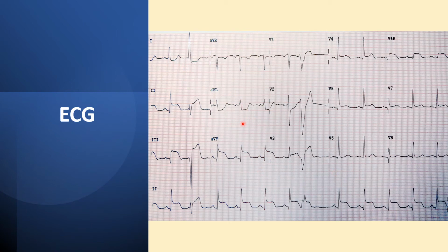There appears to be some ST elevation about 1 to 2 mm in chest leads, especially V1, V2, and V4. To be significant, it should be 2 or more mm ST elevation on contiguous chest leads. So currently, it does not meet the threshold of MI in anteroseptal leads. These unusual QRS complexes are ventricular ectopics.